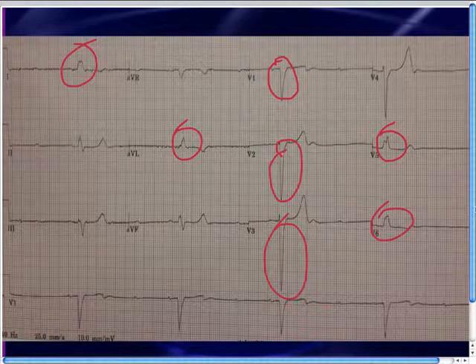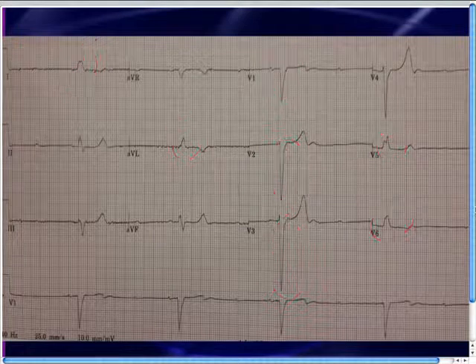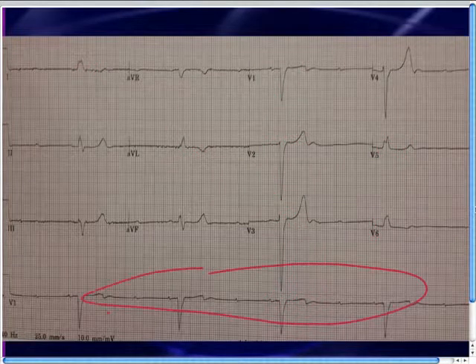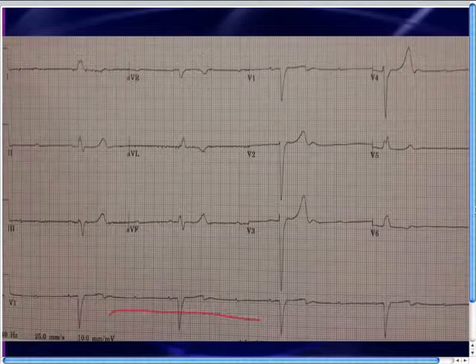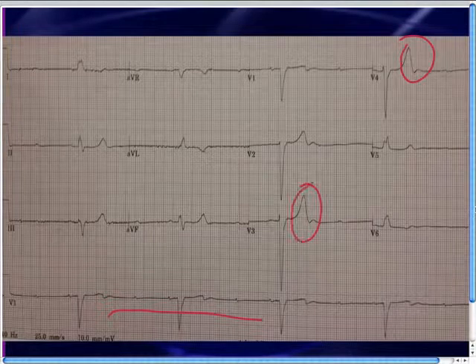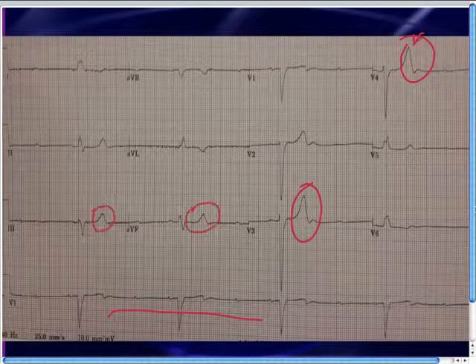Now, one other thing that you might notice, and I have to be honest, I did not notice this initially. It took a little while before noticing this because I looked at this and I just focused on the rhythm, but it is a nice reminder to me also, you've always got to look at the whole 12-lead EKG. What else is going on besides just the obvious abnormality there? And maybe you'll notice that these T waves are kind of big and they're just a little bit sharp at the top. These T waves aren't that tall, but they are a little bit sharp at the top.